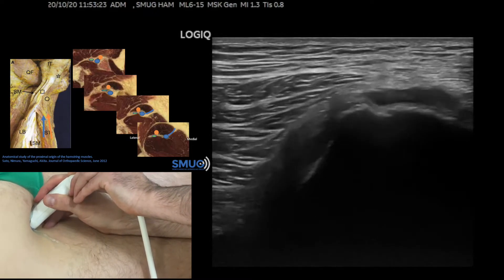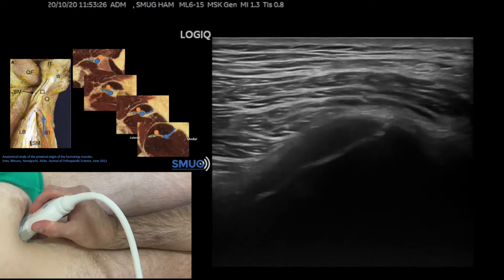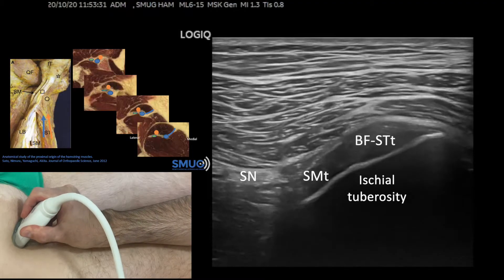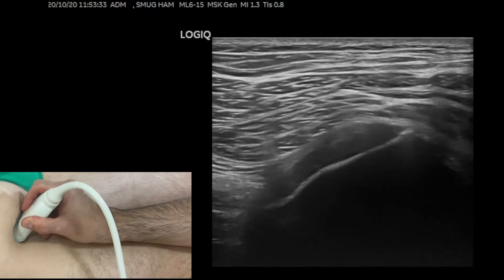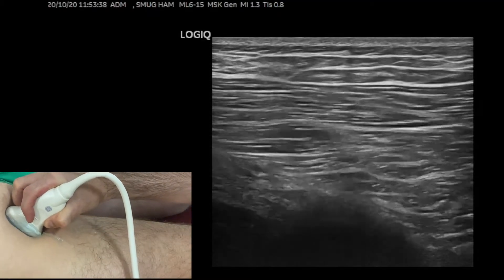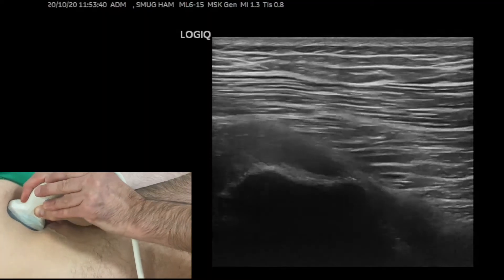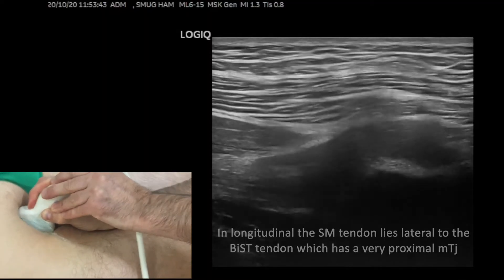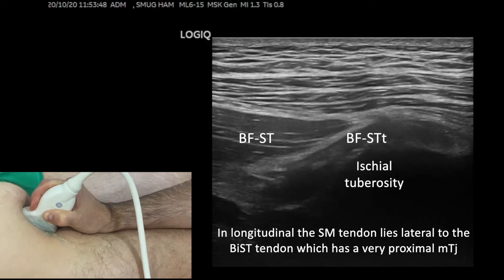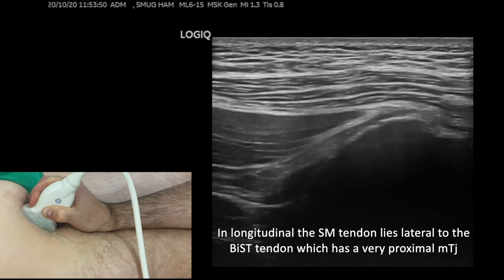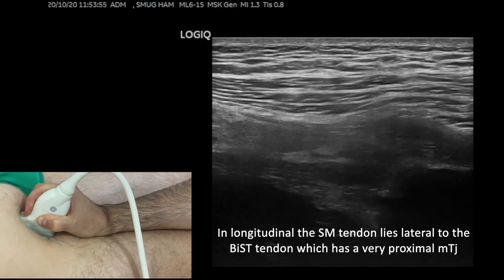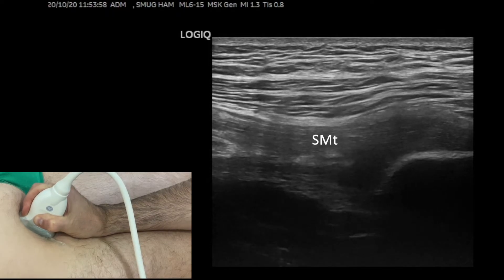There — that's an oblique picture so we need to move the probe so we can see the footprint a little better. On the lateral side is the sciatic nerve. When we spin the probe we can see the longitudinal aspect of the hamstrings. We need to bear in mind that on the medial side there's a short tendon and a muscle belly next to it, which is the semitendinosus. Semimembranosus lies more lateral and it's a thick tendon — that's the way to identify both structures.